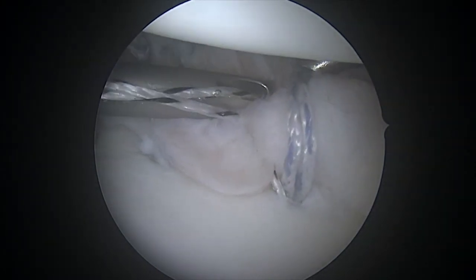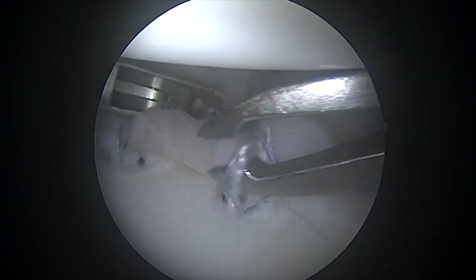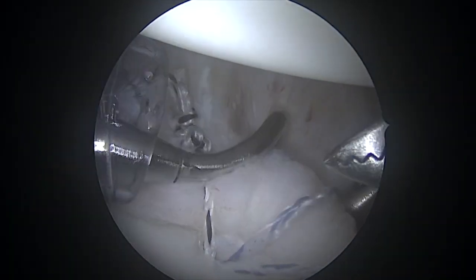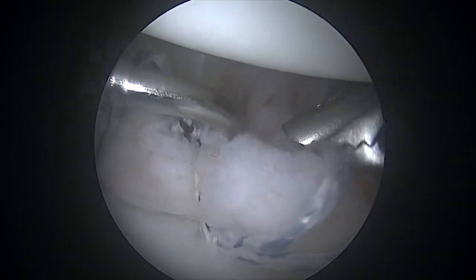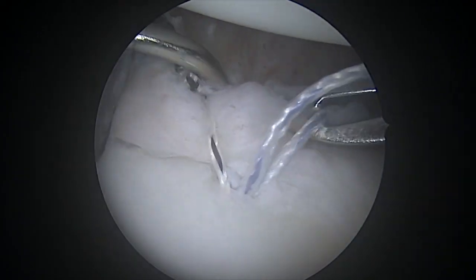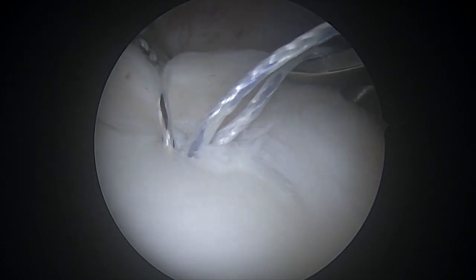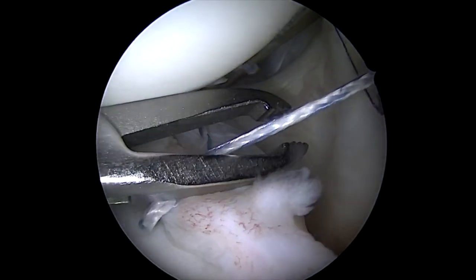I'm using a very specific process here to avoid suture tangling. That's really important. If you use double-loaded anchors, you've got to be really careful — it's really easy to get these tangled. We do a lot of work here to try to get super big bites and make sure the suture comes out exactly where it needs to.